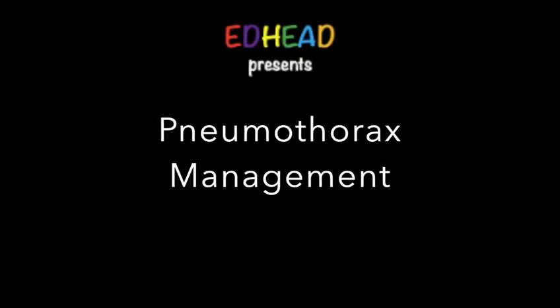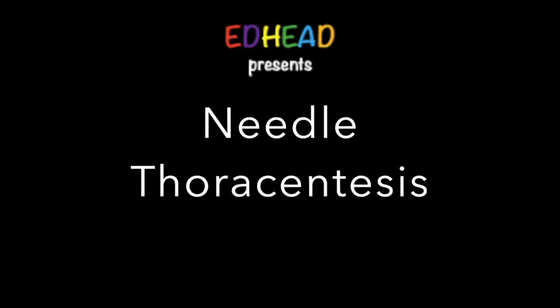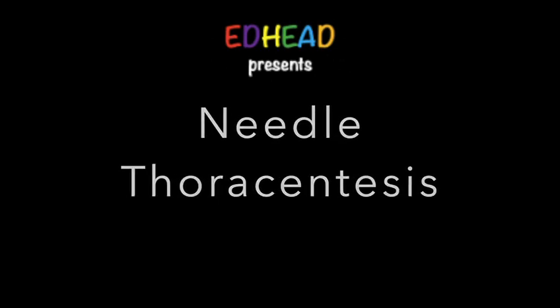EDHEAD presents pneumothorax management. Needle thoracentesis. Indication: an acute respiratory collapse due to pneumothorax.